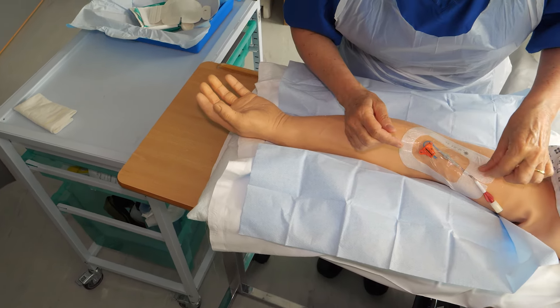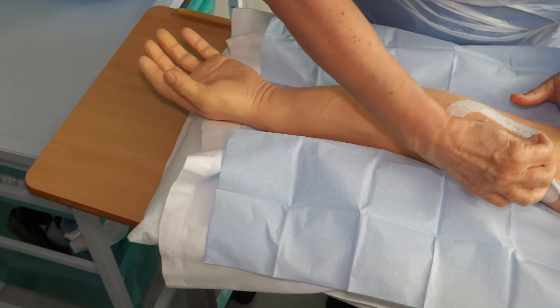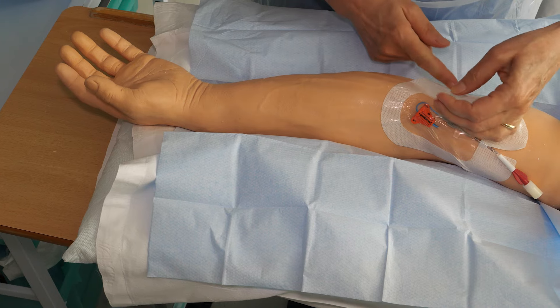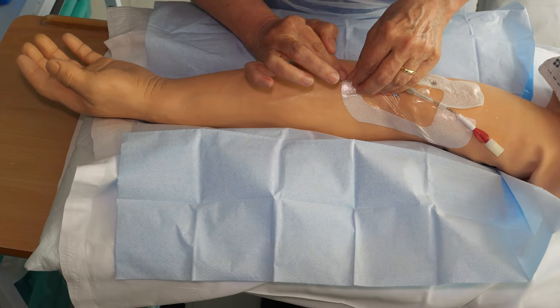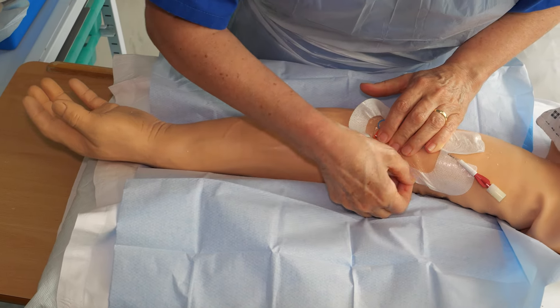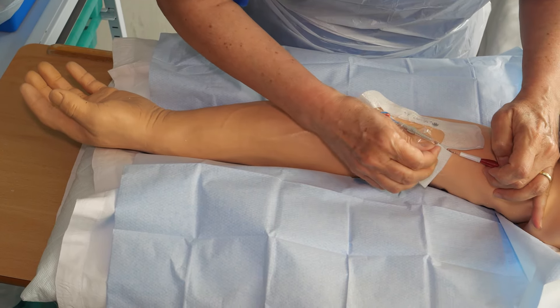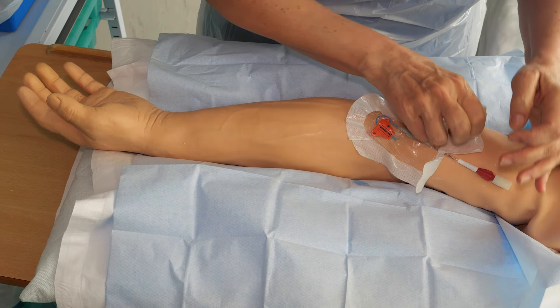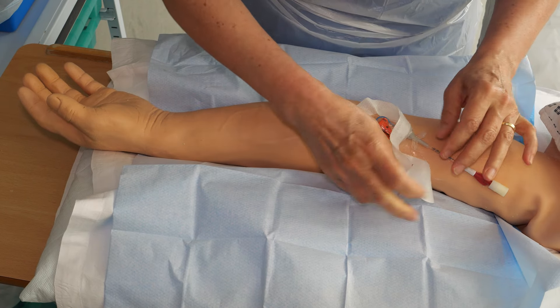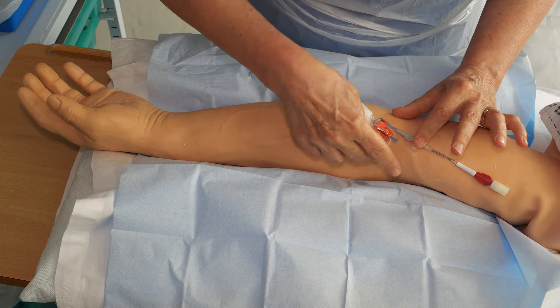Very gently remove the dressing — start by slowly lifting the edges. The dressing might be sticky, but very gently pull back and support the skin underneath as shown. Continue doing this until the dressing is released.